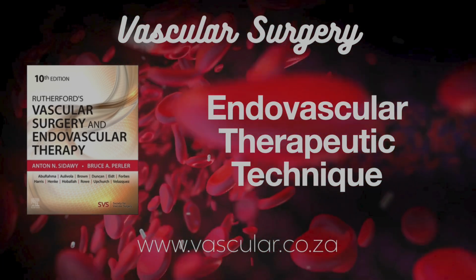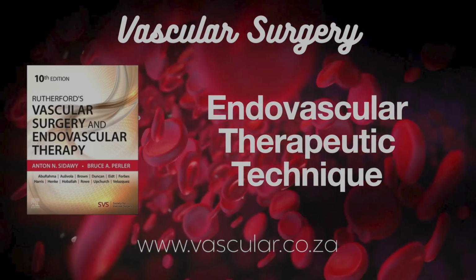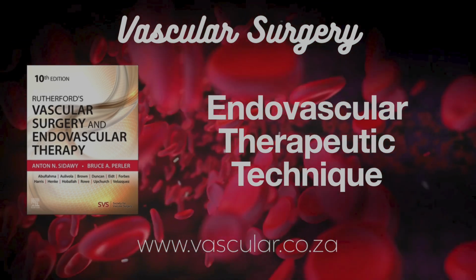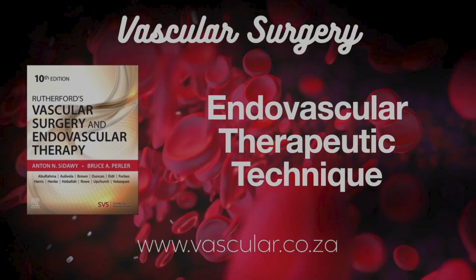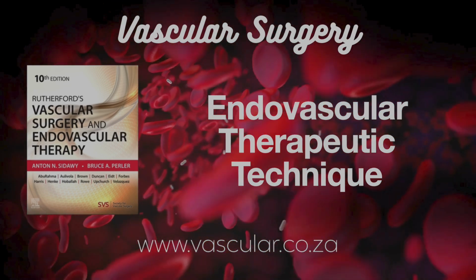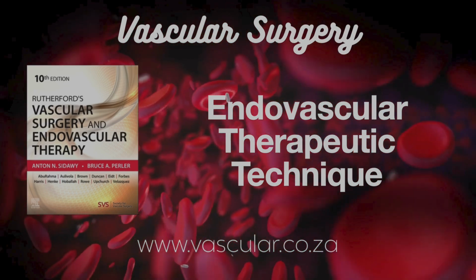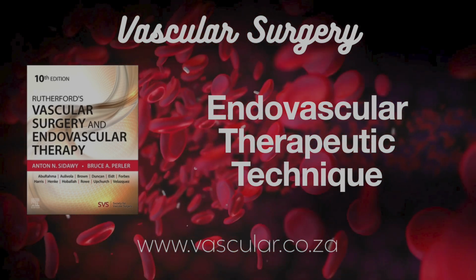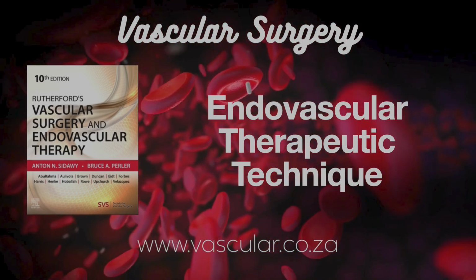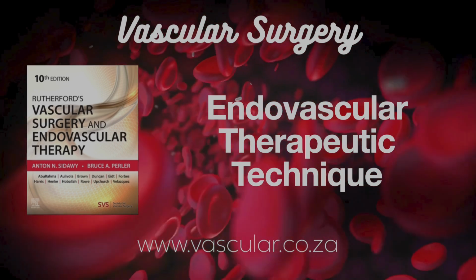And in the legs, peripheral arteries. How's the experience been? Less encouraging so far, unfortunately. The GIIA study looked at an early coronary BVS, Igaki, in femoropopliteal lesions. High technical success putting them in, but really high restenosis rates at 6 and 12 months. What went wrong? Looking at the re-narrowed tissue showed a mix of things. Typical scar tissue growth, leftover stent material, inflammation, clot. And other registry data comparing that BVS to modern nitinol SES in the SFA also showed lower patency with the bioabsorbable one.